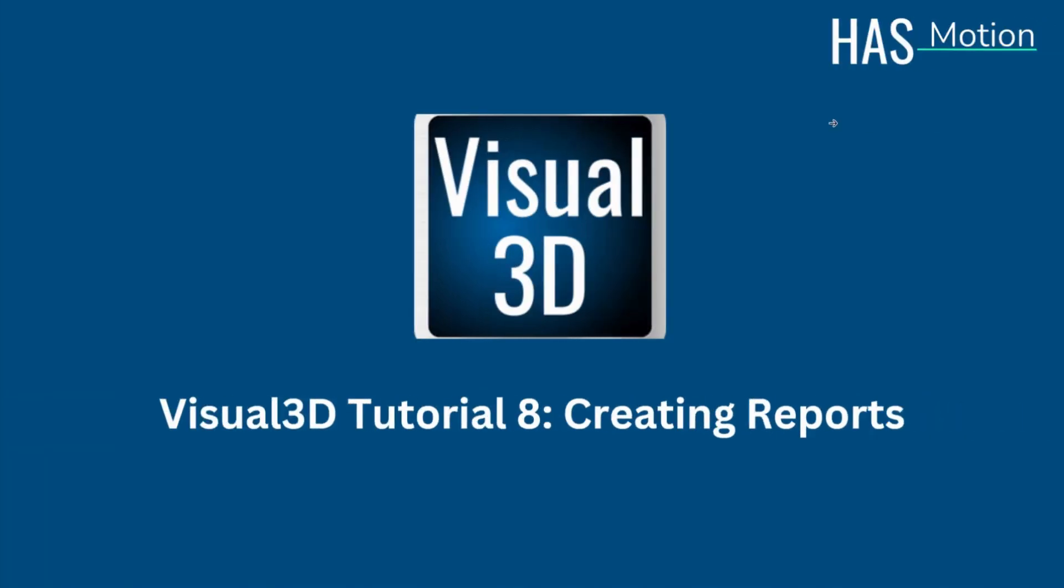Hello everyone, welcome to the 8th Visual 3D tutorial video. This one is on creating reports within the application.